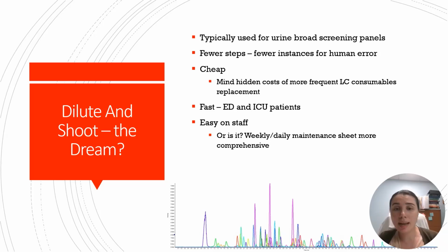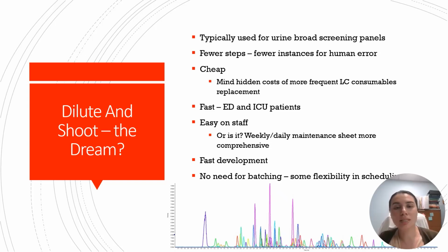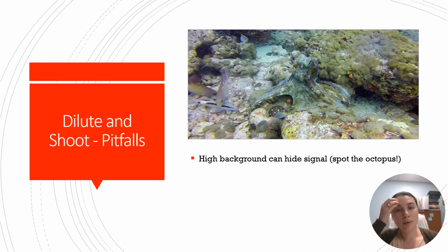It's easy on staff, or is it? Because it does lead to more involved weekly and daily maintenance sheets. Definitely faster in development, and it does allow you to not batch, so that allows for some flexibility in scheduling. However, there are pitfalls. High background can hide the signal.